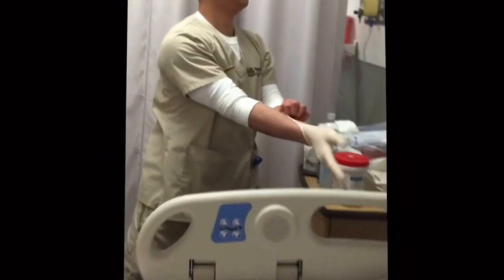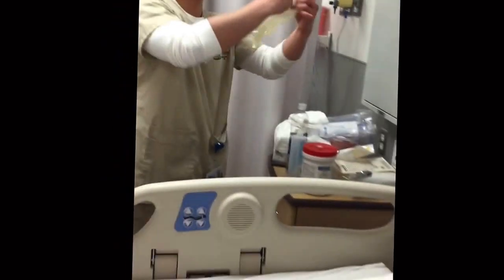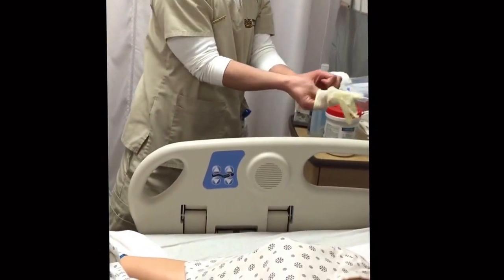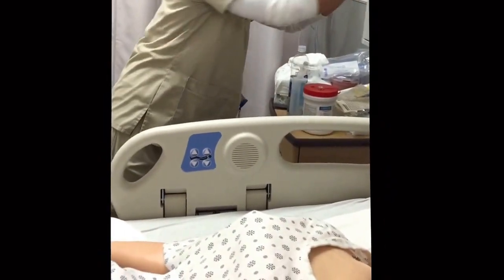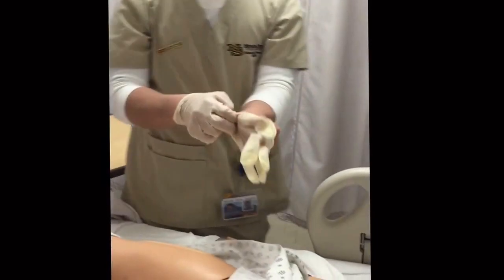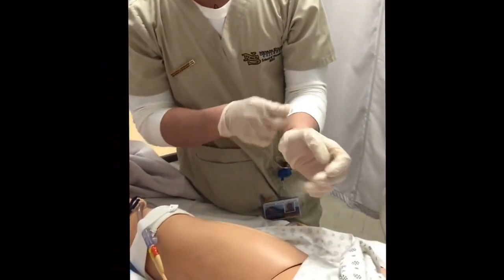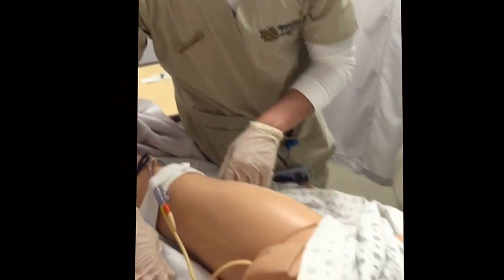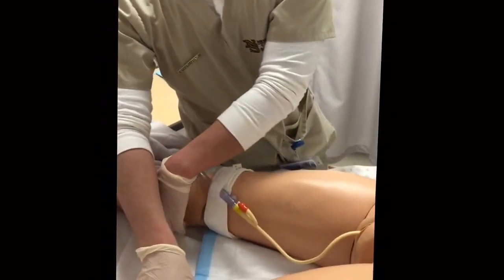And then just take a deep breath in for me and deep breath out, okay? If you feel any pain, please let me know. It's not supposed to hurt. You might feel some discomfort or some pressure. That should be normal, but if it's painful, let me know right away, okay? So make sure you assess her vaginal area, check for any bleeding or discharge. And if the chux is wet, you can go ahead and take this off and put a new one.